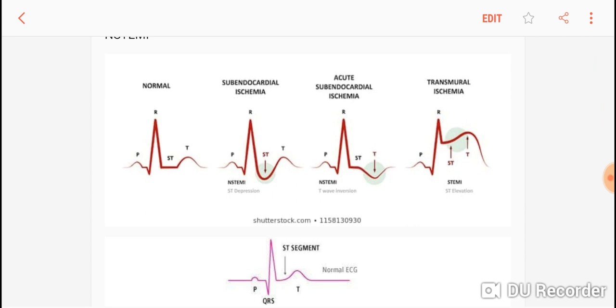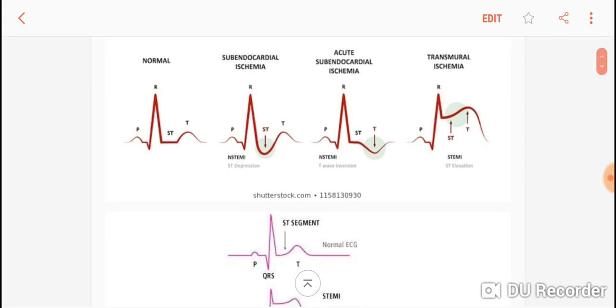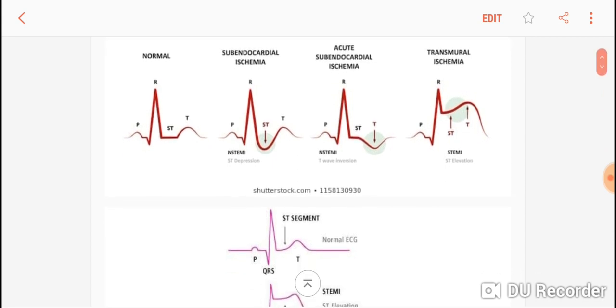In the third figure you see a T wave that is downwards, an ST segment that is normal. It can also be an NSTEMI. You can have ST depressions, you can have T wave inversions in NSTEMI.